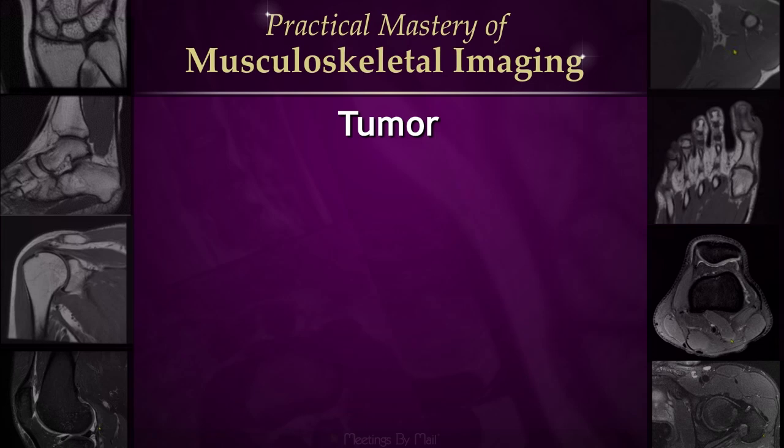In the general practice of radiology, you'll often be the first one to see these, and it's helpful if you make a standardized detailed report. You may also be following these after treatment. And so let's go through the things that we need to mention in a report for soft tissue tumors.